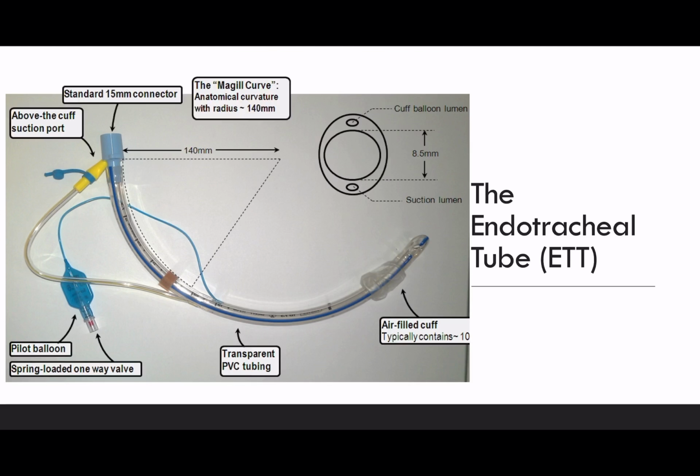You want to try and reduce the pressures that the lung sees. The higher the pressure, the higher the chance that the lungs may develop a pneumothorax. Again, it's like blowing up a balloon. If you blow it up with a lot of pressure, a lot of force, you might blow that balloon, whereas if you blow it up slowly, there's much less risk of the lungs being damaged. And that's what we call barotrauma, and you'll hear a lot more about that a little later in the series.